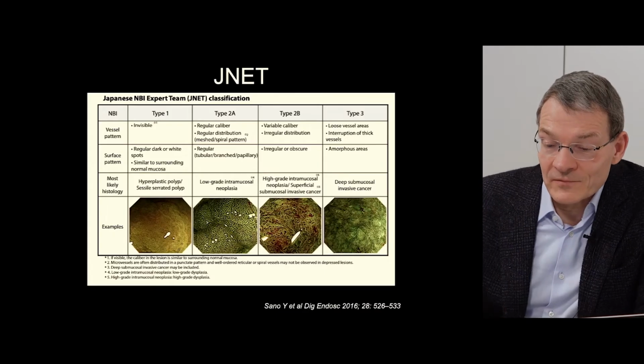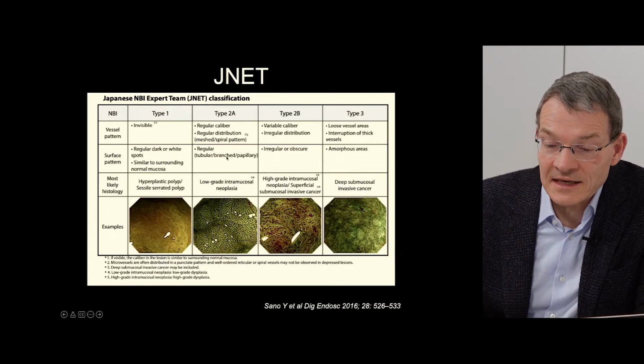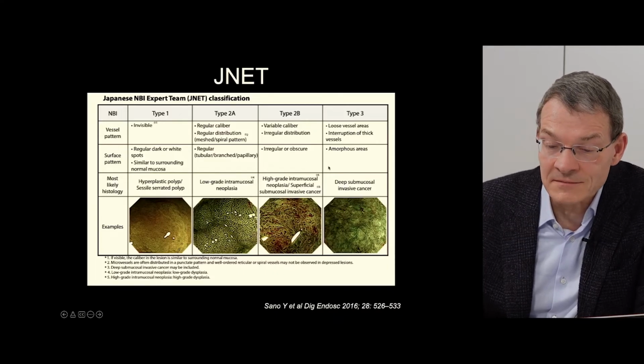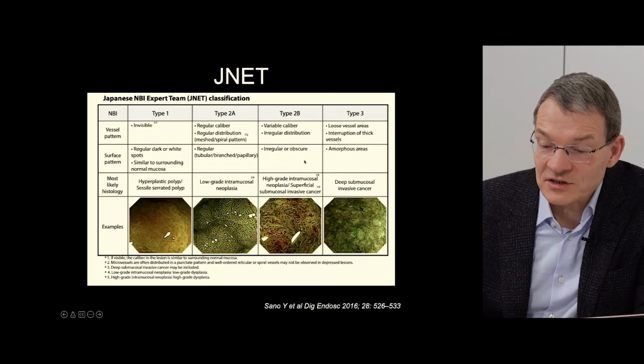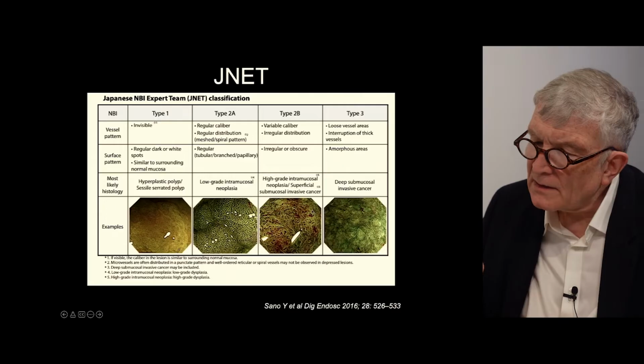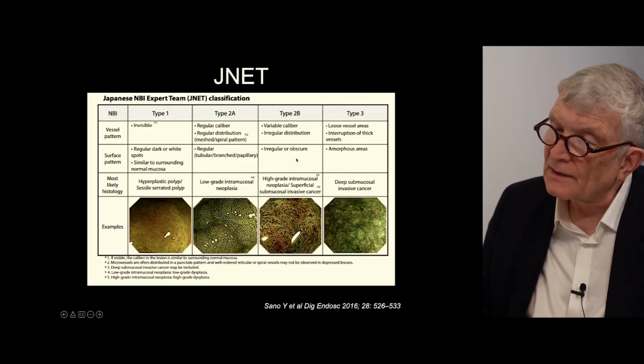Yes, so what I want to say is now type 2A to B, here it comes that the surface patterns are also described in this classification, but I don't know, to be honest. So tell us again, 2B is what?